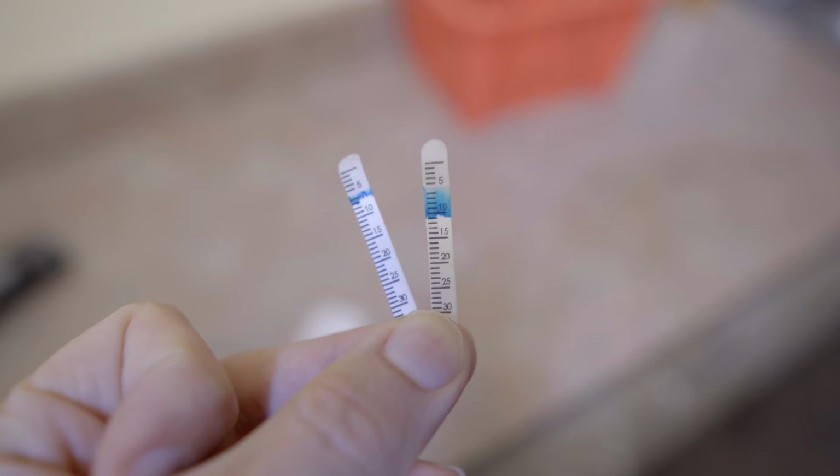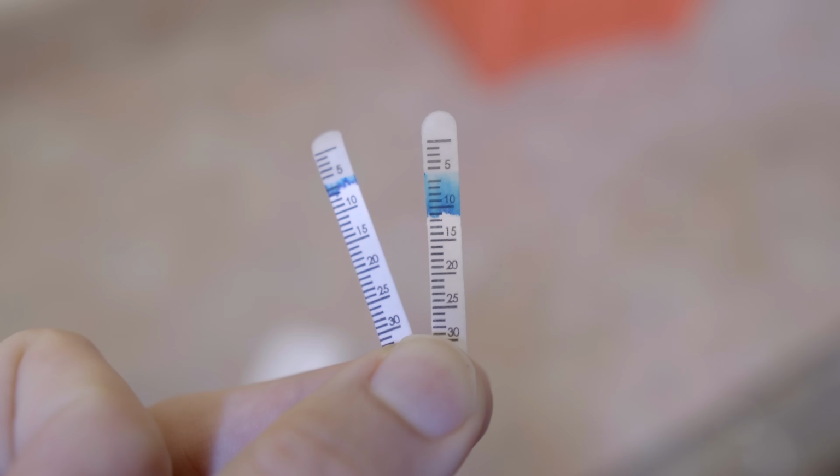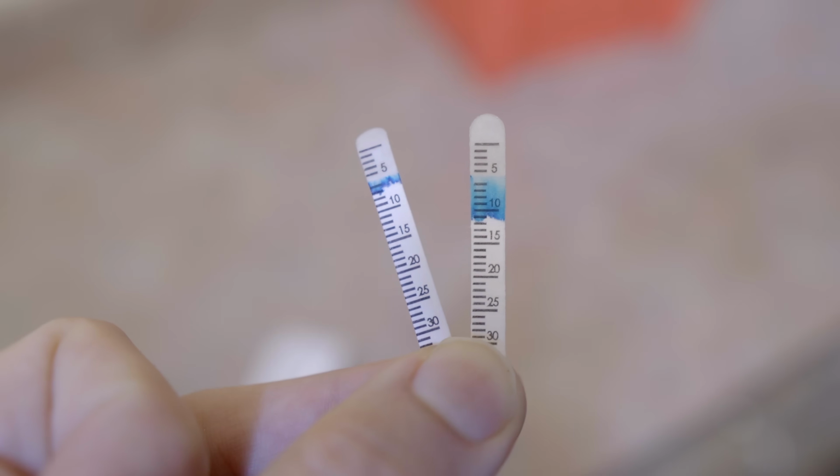In general, if somebody produces more than 10 millimeters of tears in a 5-minute period, then they're considered to have more normal tear production. But if somebody has less than 10, then that is significant for dry eye disease. And if somebody has something like 5 millimeters or less, then I'm seriously considering if somebody has an autoimmune component, like something like Sjogren's syndrome, for example.